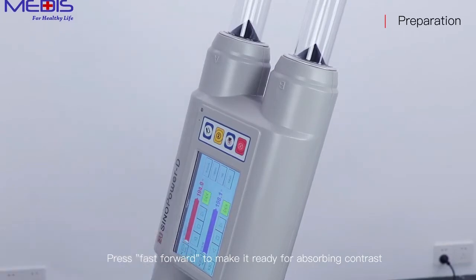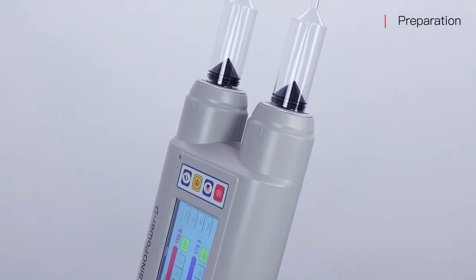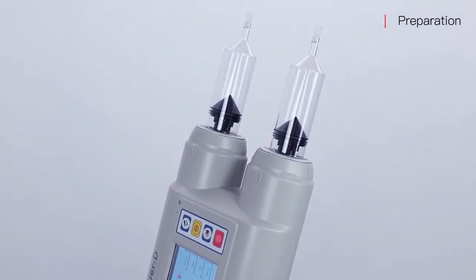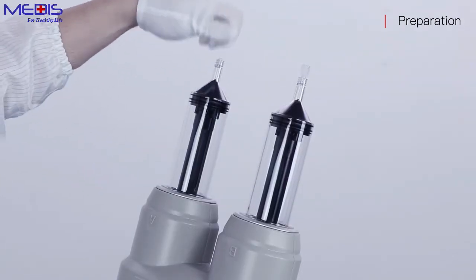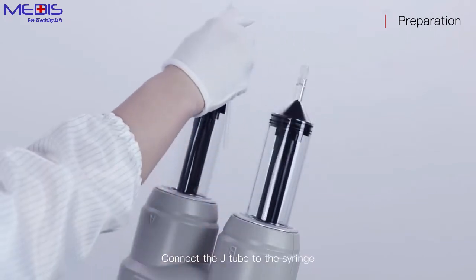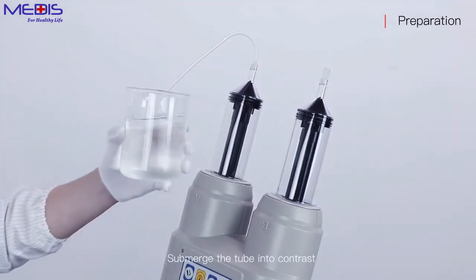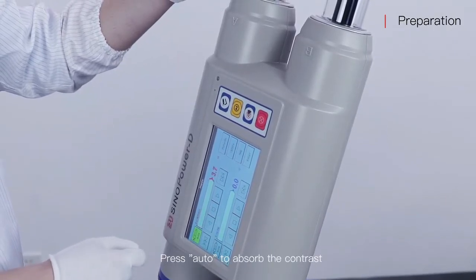Press fast forward to make it ready for absorbing contrast. Take over the cap of the syringe. Connect the J-tube to the syringe. Submerge the tube into contrast and press auto to absorb the contrast.